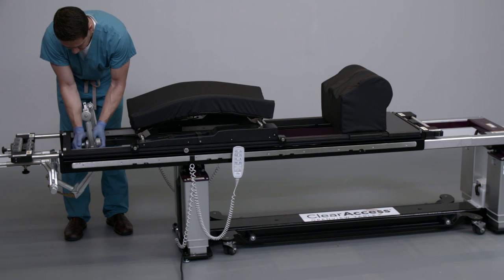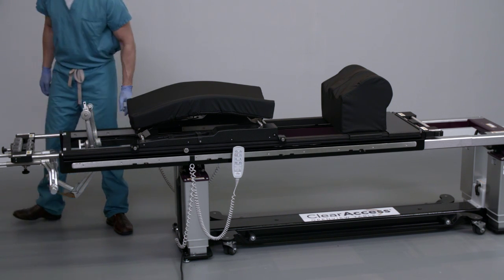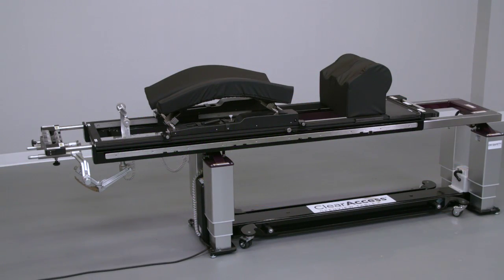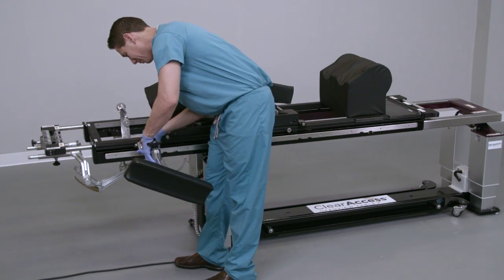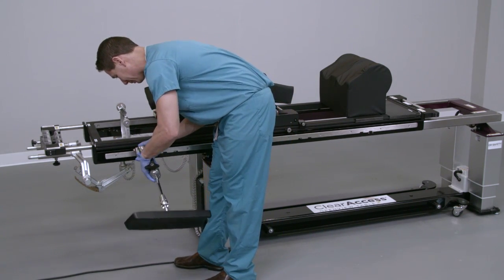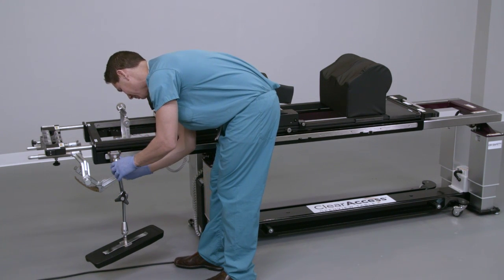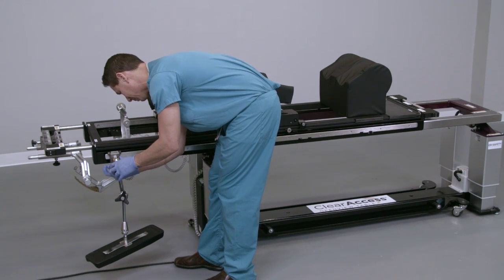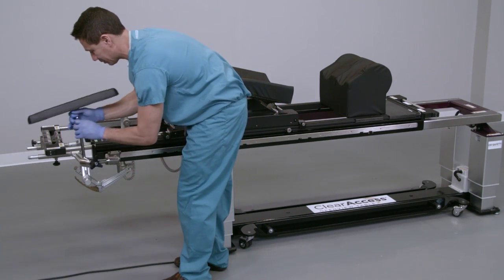For many posterior cervical cases with cranial stabilization, the patient's arms are secured to the patient's body and arm boards are not necessary. In the event that arm boards are to be utilized, install the Clear Access multi-directional arm boards by engaging the side rail of the table with the arm board lock at a superior position to the side rail. Once engaged, tighten the locking mechanism firmly. Make sure the position of the arm board will not interfere with the surgical staff during the procedure.